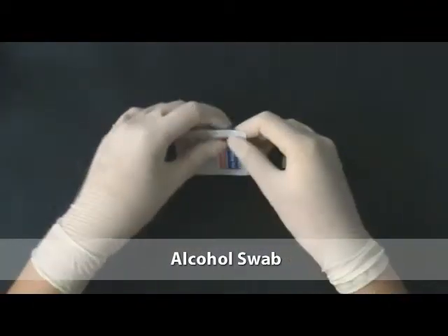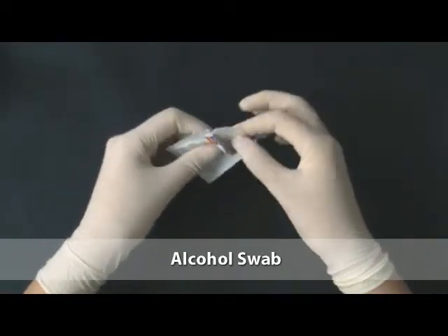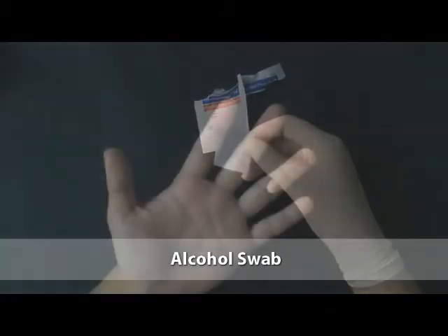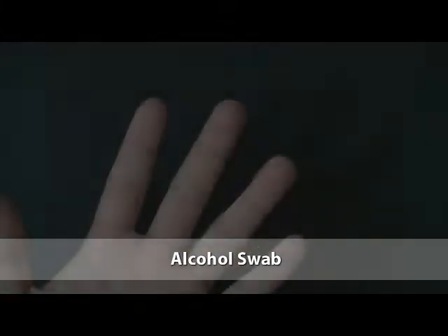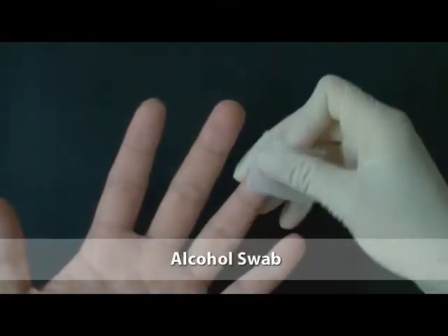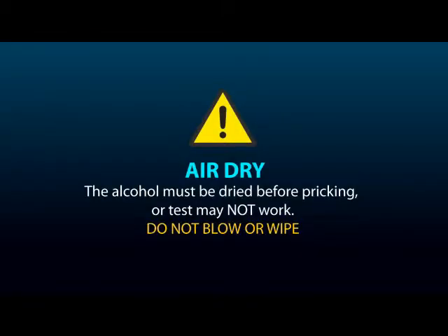Open the alcohol swab. Grasp the fourth finger of the patient's hand and clean the patient's finger with the alcohol swab thoroughly. After cleaning the finger, it must be allowed to air dry. Remember, the alcohol must be dry before pricking, or the test may not work. Do not blow or wipe the finger when you dry it.